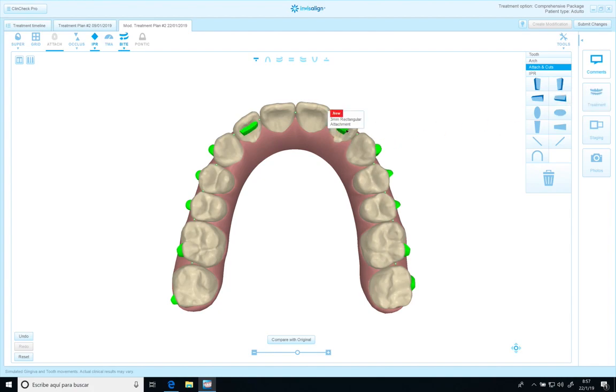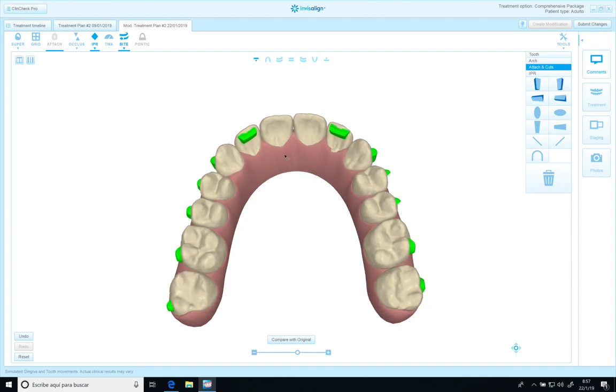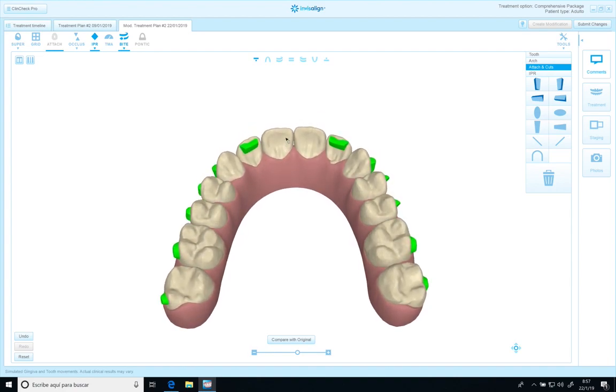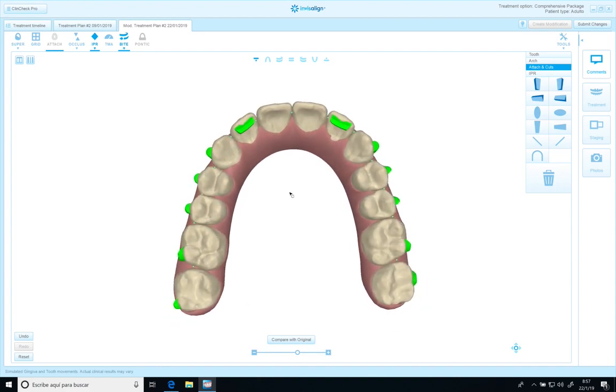I'm going to change to five millimeters. Something that I like to do, I like to put it as close as possible, closer to the incisal edge.